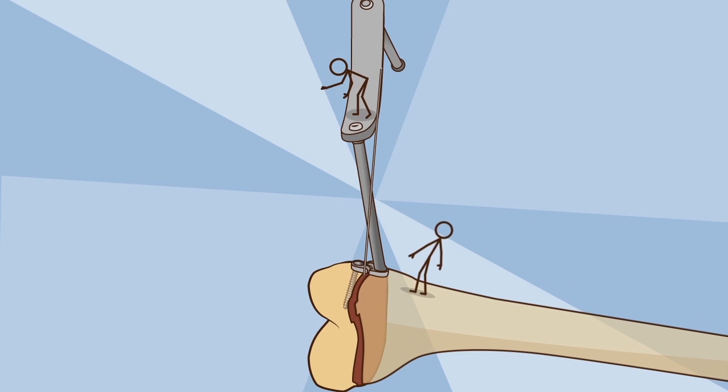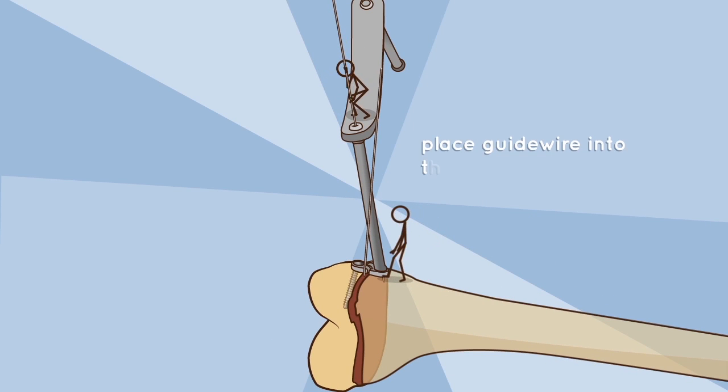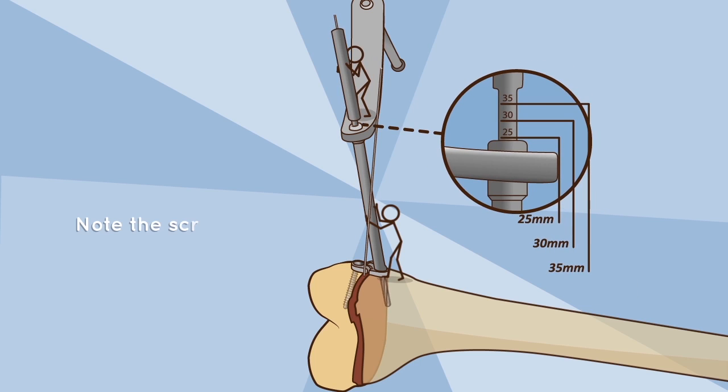Metaphyseal hole preparation: using the dual guide, place the guide wire into the metaphysis away from the growth plate while maintaining pressure with the dual guide to ensure bone contact. Drill over the wire and note the screw length required.